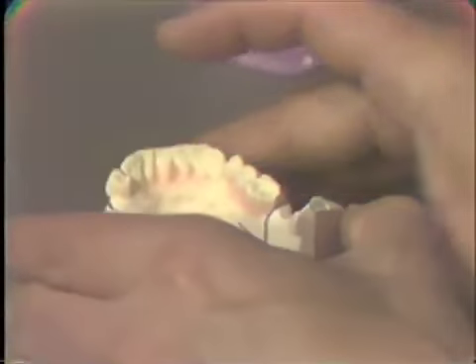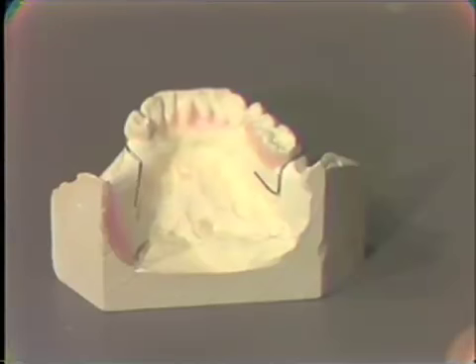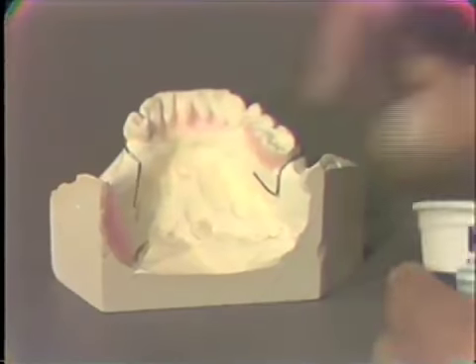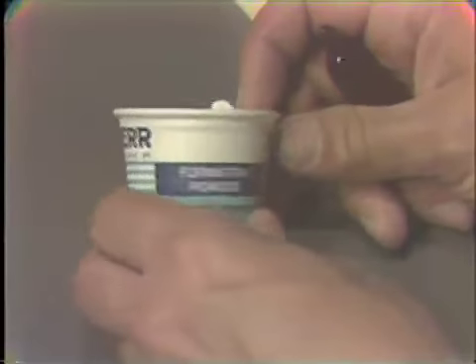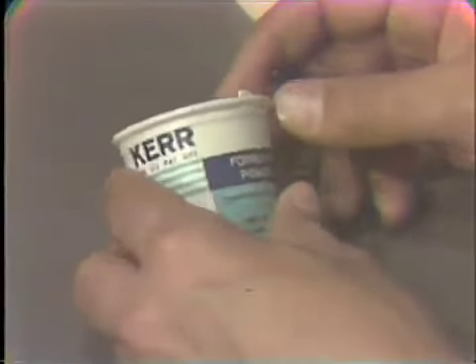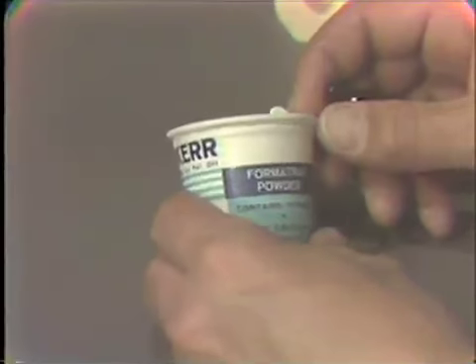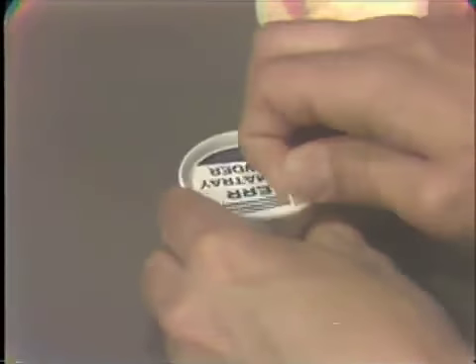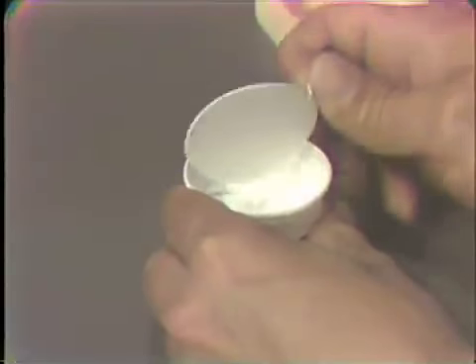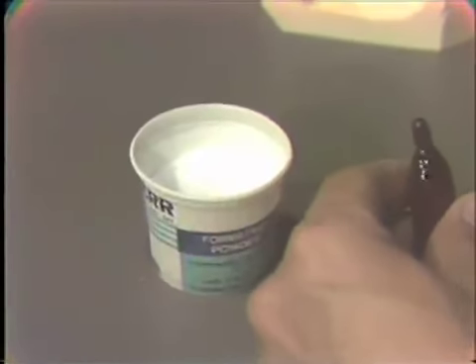Now, the acrylic, when the liquid foil has set, the acrylic that we will use in this case is the Formatray material. Now, this has a lot of filler material in it, and it is not the most accurate of all the acrylics, but it will suffice if we're not going to store the jaw relation record base for a long period of time, if we use it rather quickly.